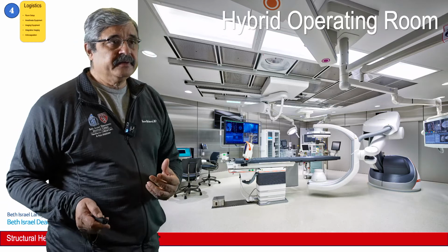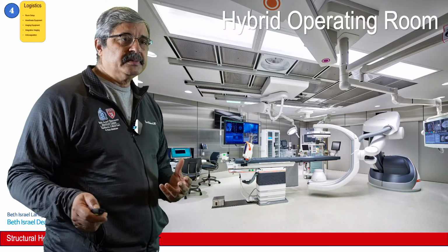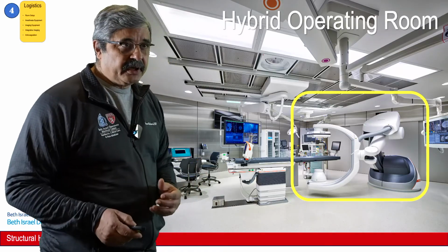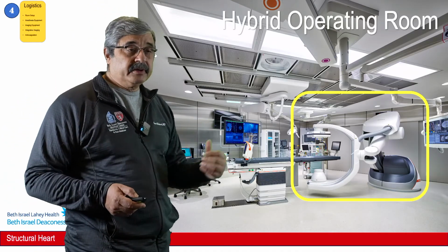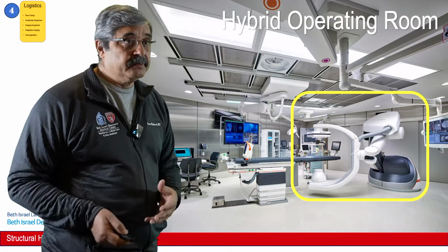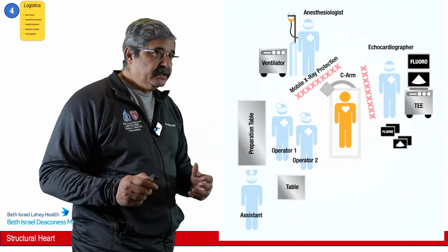I'm sure you all have seen this hybrid operating room. You have a bunch of them in your medical center. We've just been blessed with about 6 of them. We do a lot of this stuff in our hybrid operating rooms. The key part in this one is this machine, which is the C-arm, a menacing looking, robot kind of a thing, which moves very fast and is very, very powerful. I have myself been knocked out a couple of times with this machine and hurt my knee. And our ultrasound machines have multiple times been broken by simply the force and the speed of motion of this machine. So you've got to keep these things in mind.